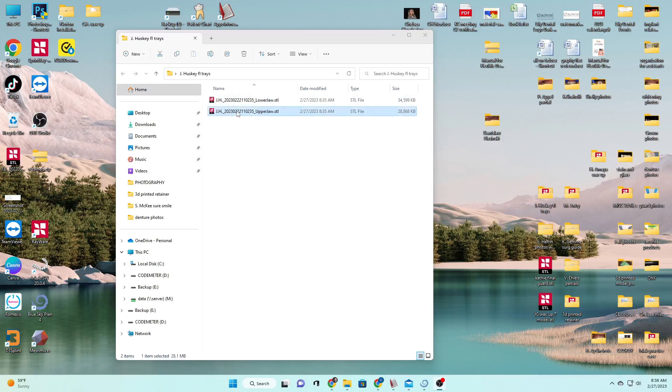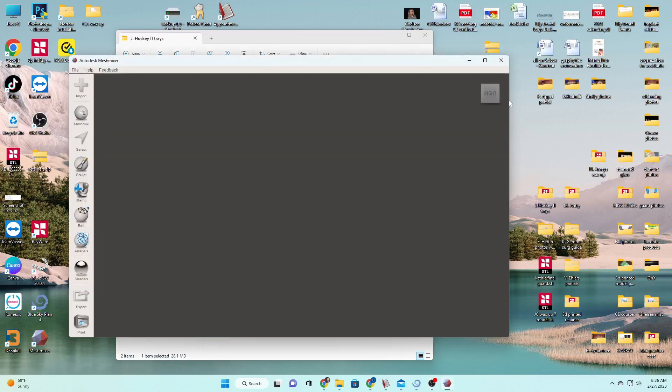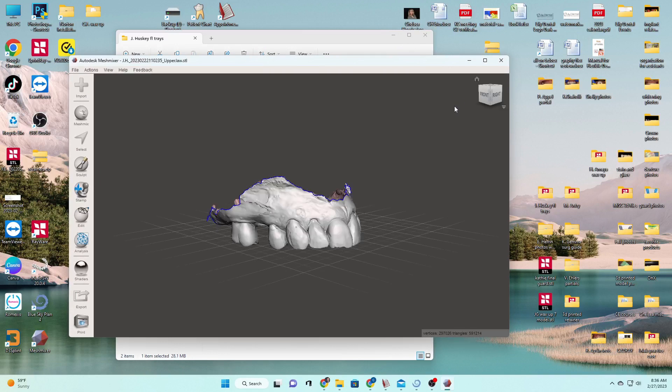First things first, to make our solid models, we need to bring our scans into MeshMixer. That's that free program for anyone to use. It's not dental related, but you can still do plenty of things on it for dental.